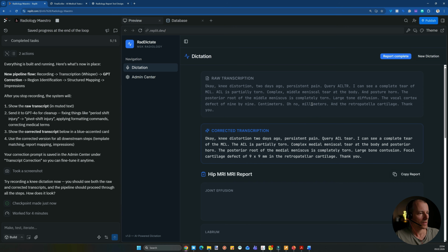And this is the exact same. Oh yeah, no, it fixed something. So you can see I was saying, oh no, millimeters, not centimeters. It fixed this. So it's actually fixing stuff. Completely torn, large bone contusion. This should be not a bone contusion, but a joint effusion. Add voice editing to the corrected transcript.